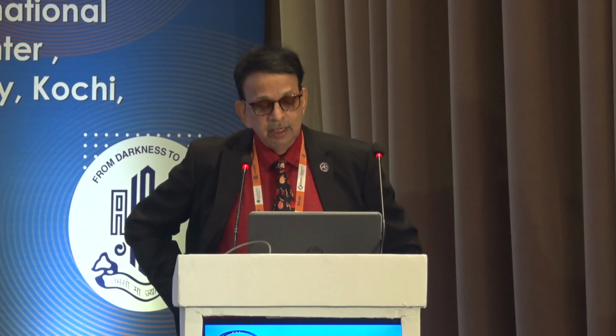Just to show you another patient with a grade 3, grade 4 cataract, the rhexis is done already, a free floating rhexis most of the time, 99% of the time. You can see here I'm just using a Sinskey hook and burying that. Because the pre-cut is already there, the pre-chop is already there, the femto liquefaction is already there, the cutting is already there with the femto laser, it's easier for you to separate the nucleus and go ahead with the surgery. And these are octants. Sometimes you do six sextants, but I do octants because I want more pieces, that is 8 pieces, so that it makes life easy for us.